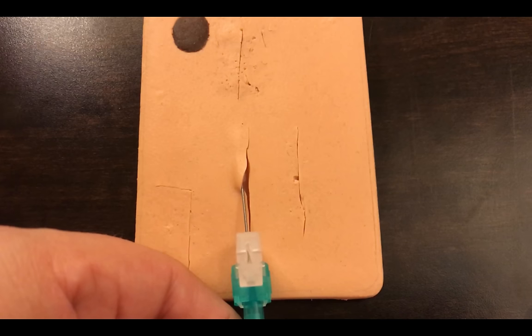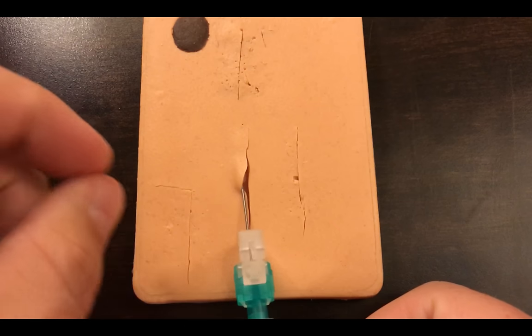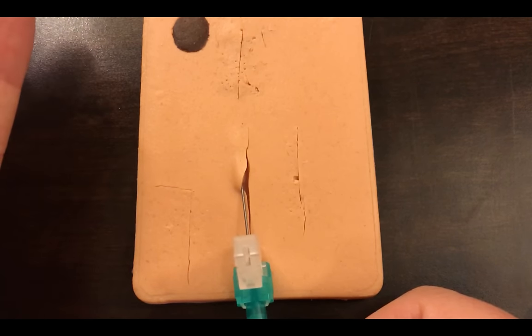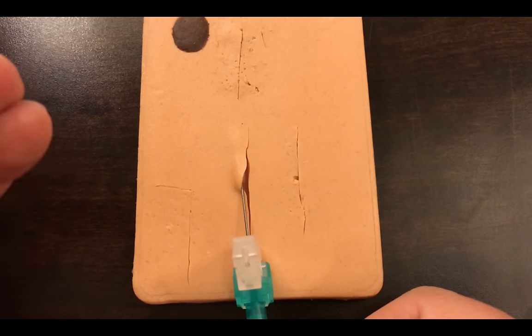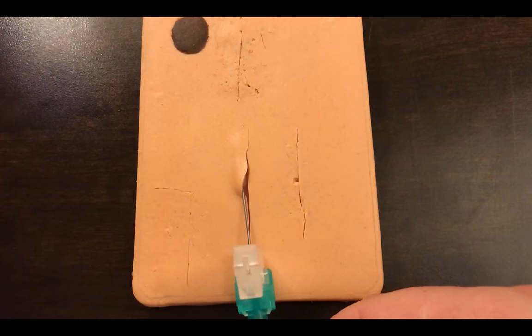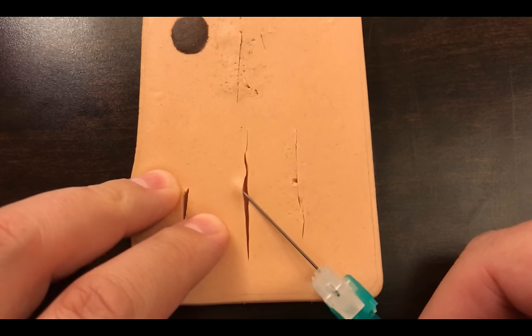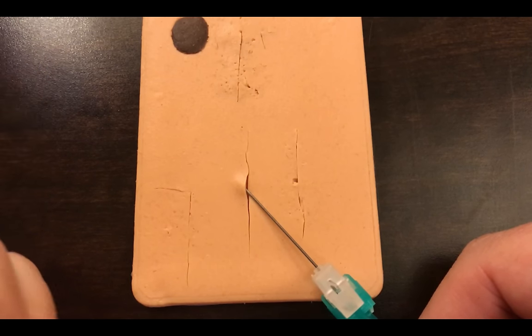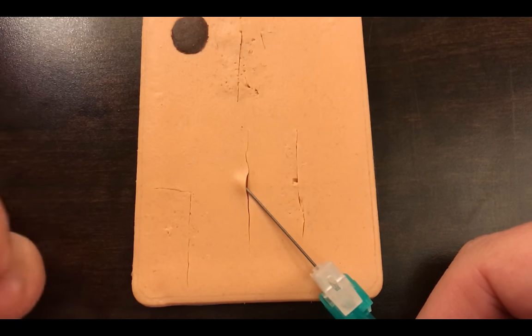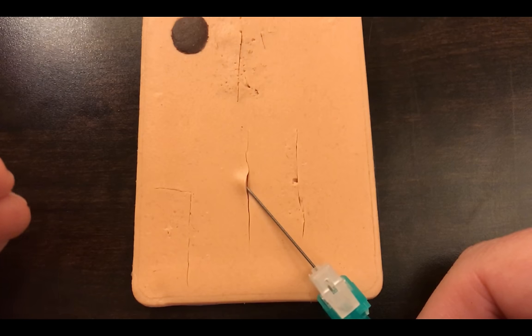I generally like to pull back just a little bit on the plunger to make sure the tip is not in a large vessel. If I start to aspirate and get blood pulling into the syringe, I know I'm in a large vessel — and I shouldn't inject lidocaine into a large vessel. Lidocaine is an antiarrhythmic medication; injecting a large amount into a vessel could cause heart arrhythmias. I do a slight aspiration first, then inject slowly as I withdraw the needle. Some ask why not inject as you advance — but if you advance into a large vessel you'd be injecting directly into it, and the anesthetic takes several seconds to kick in anyway.